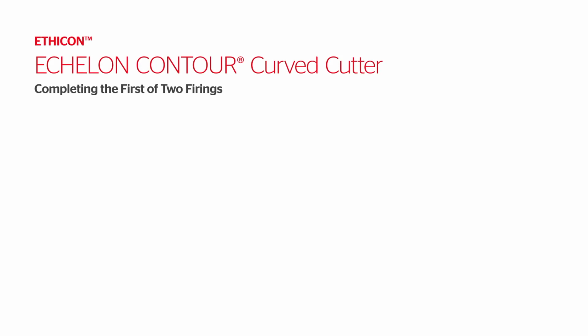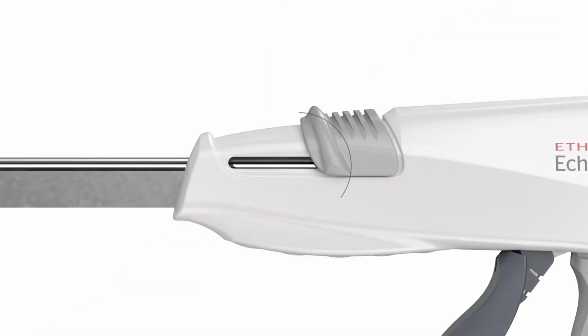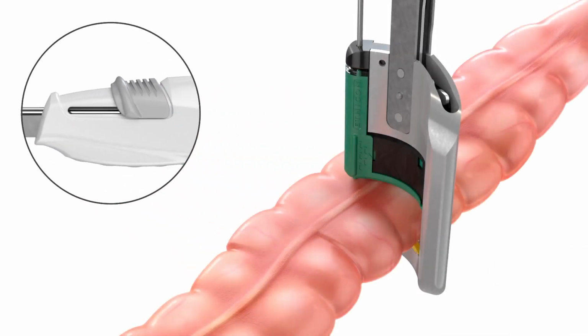Completing the first of two firings. For the first firing, ensure that the device reaches more than halfway across the tissue that you are going to transect. Using the actuator button on top of the handle, manually advance the retaining pin until it pierces the tissue.